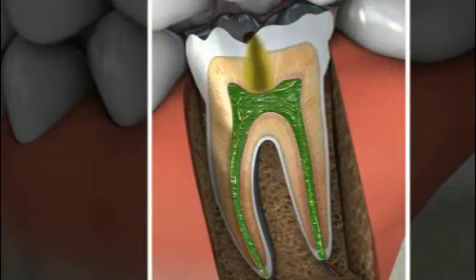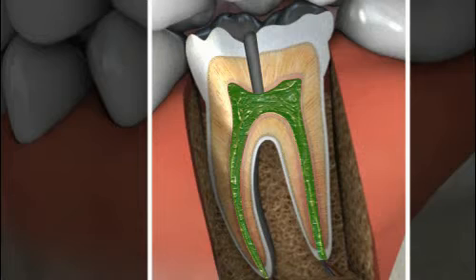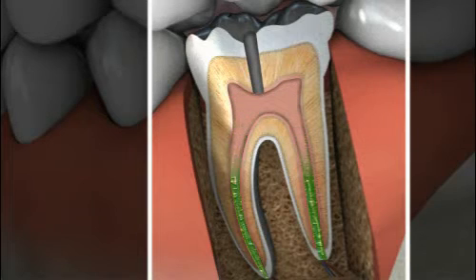Of course, the first step in the procedure is to make sure the area is completely numb using a local anesthetic. The dentist will use his drill to gain access to the roots and pulp. The dentist then inserts tiny root canal files of increasing diameter through the egress hole to clean out debris, bacteria, and pulp tissue from the root canals.